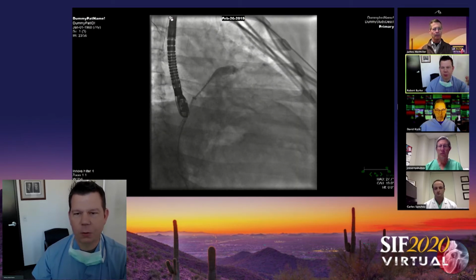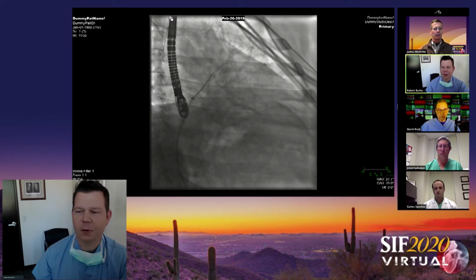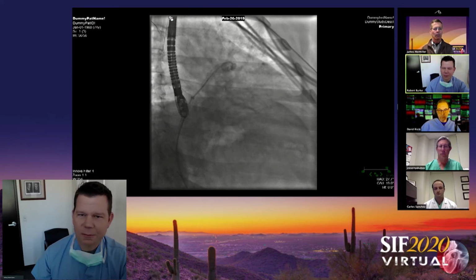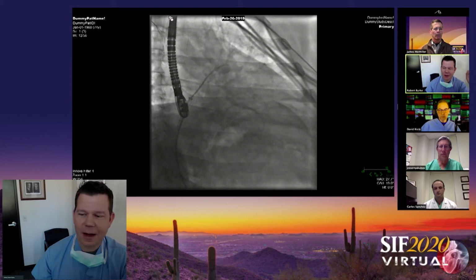We've had some challenges with CT, just like you have, Srini, because there's inconsistency with how you're supposed to make the measurement. Not all the radiologists do the exact same thing, and even some of the specialists have doubts as to where we really have to measure this to be along the long axis and get a true short axis measurement of where you're going to be working within the left atrial appendage. Just like you said, the anatomy is highly variable. It's not always going to sit by the same set of rules.